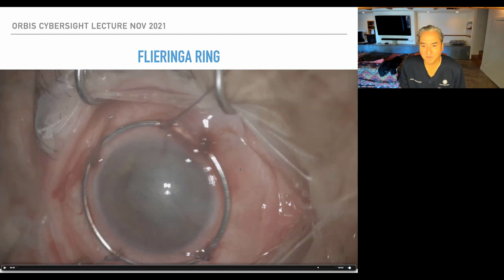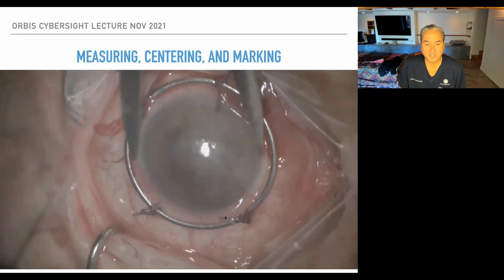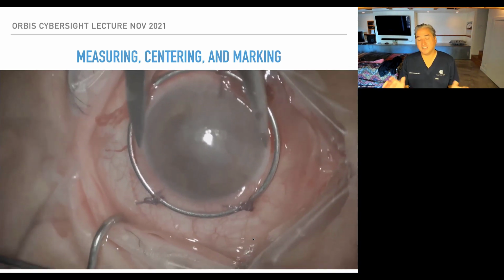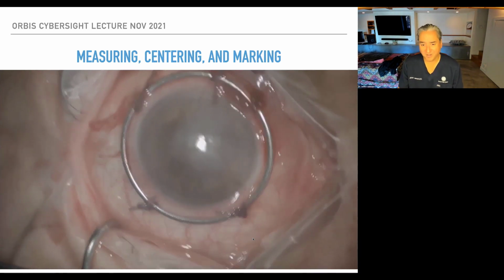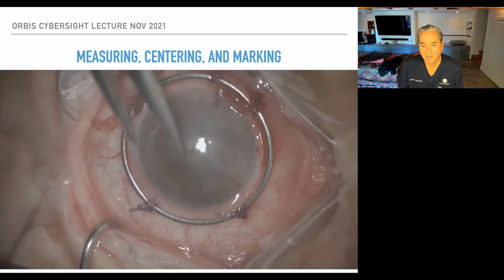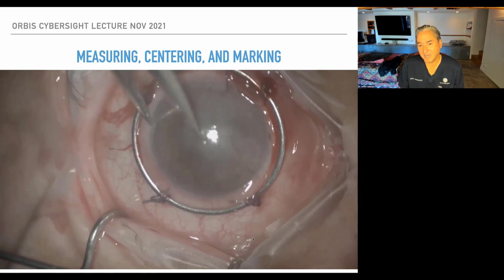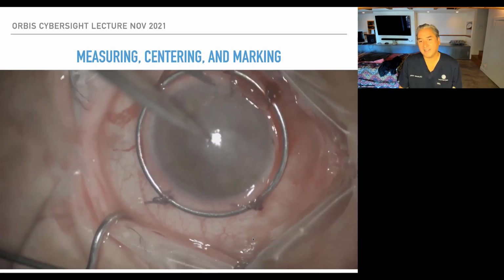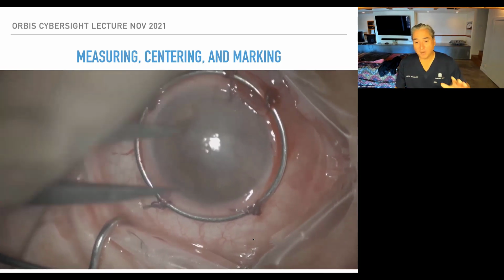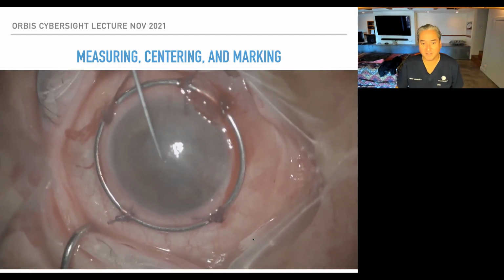All right, so we got the Flieringa ring. We know how to do that. And then in terms of measuring, the way I like to do this, in this video I go overboard and measure a lot and mark a lot, but I start with the horizontal corneal diameter, and then I mark the center of the cornea, and then I do the vertical diameter and mark the center of the cornea. That tells me where I'm going to use my little cross when I aim with the Barron trephine, the vacuum trephine.